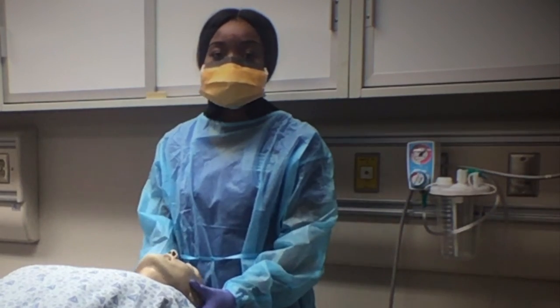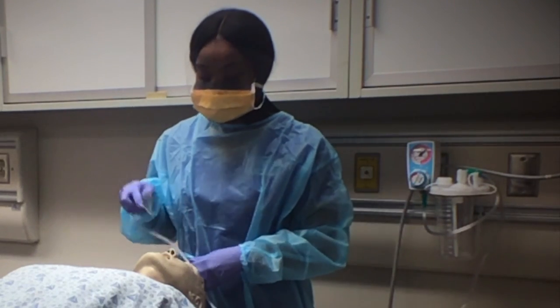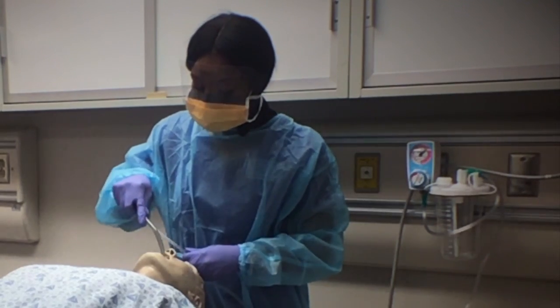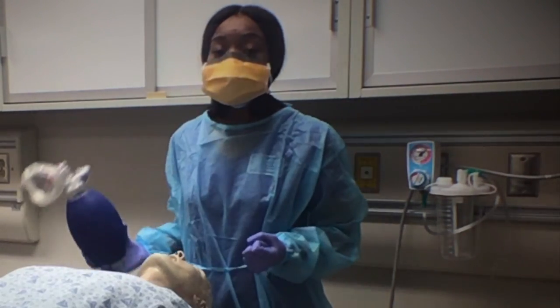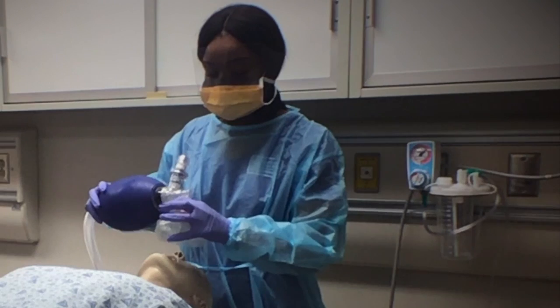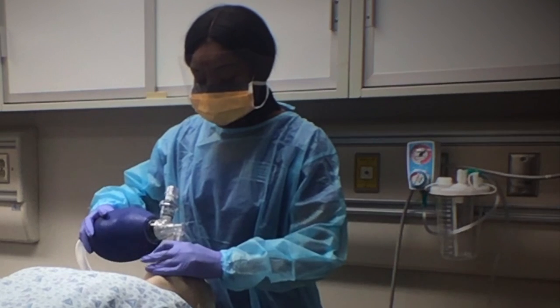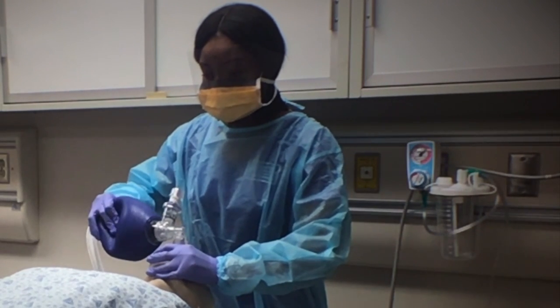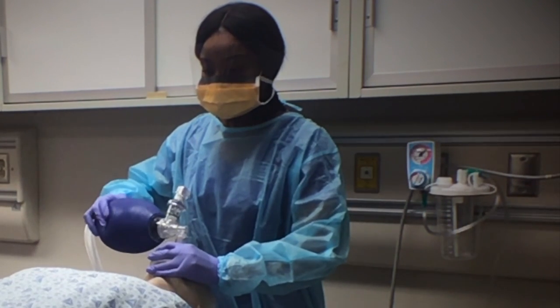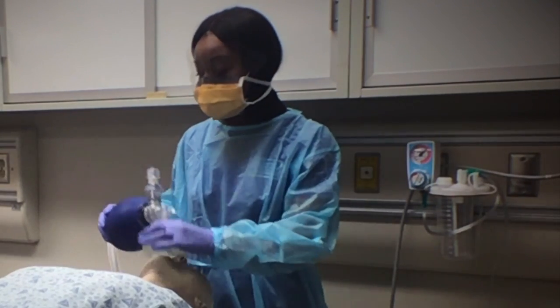I now have my patient in the sniffing position. I'm going to begin by suctioning my patient in the mouth. I'm going to now ventilate my patient for 3 to 5 minutes using the EC technique. And I'm looking for bilateral chest expansion. It has now been 3 to 5 minutes, and now we can attempt to intubate.